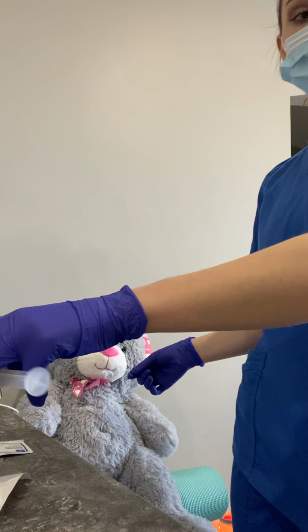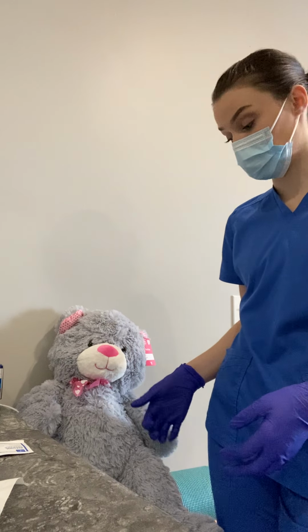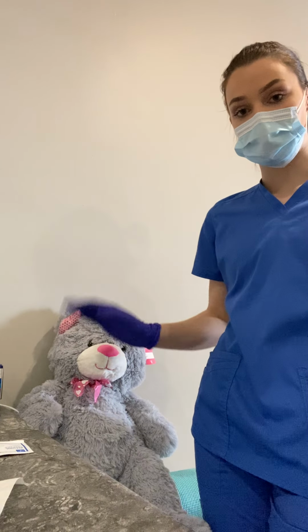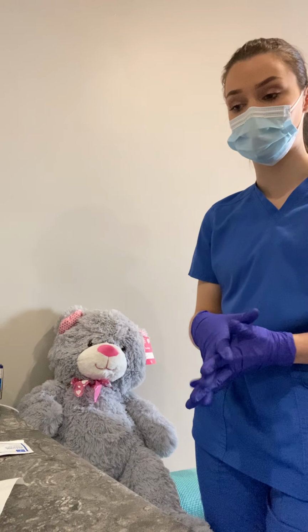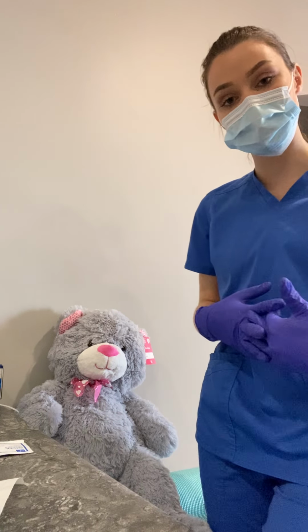So if she's got IV fluids or anything that she needs to be rehooked up to, I'm going to go ahead and do that. If not, I will clamp it, and then I will chart everything that I just did: the medications I gave, how the patient tolerated, all of those things. I'll chart that I took the blood, got the blood sample, and where I sent it to. And I think that that's it for this skill.